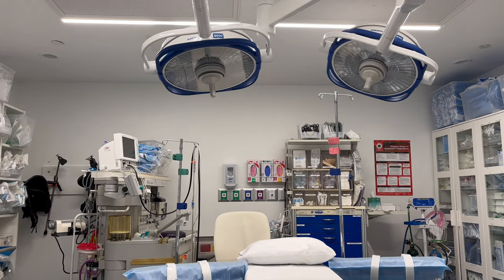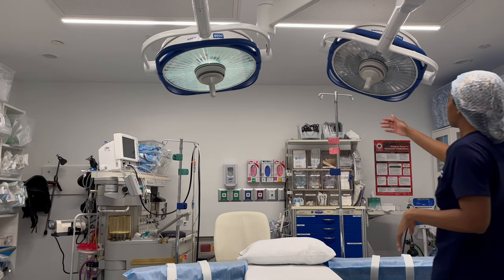So I always go ahead and make sure to check my lights, make sure the bulbs are working, because here I turned my lights on and realized that one of the bulbs was out, so we had to go change that. And again, this is a small practice. This is something that I would do. I don't have anyone to call.